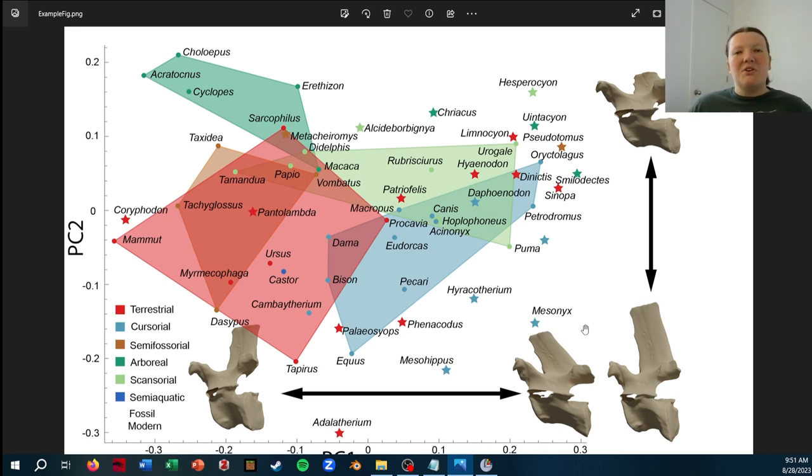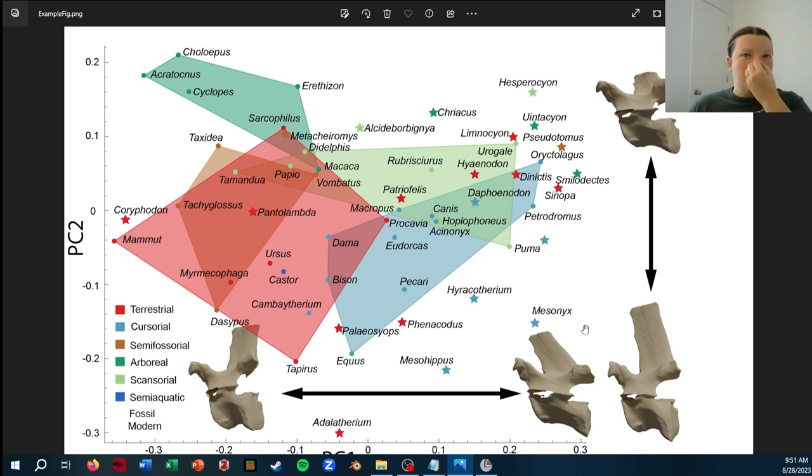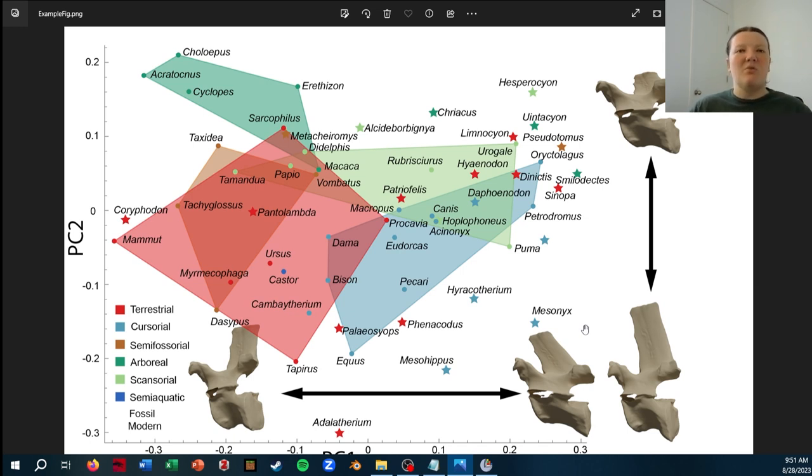Exported from Slicer, rendered in Blender, and then used Illustrator to put this all together. So I'm just going to be showing how you can start this process using the tools in SlicerMorph.